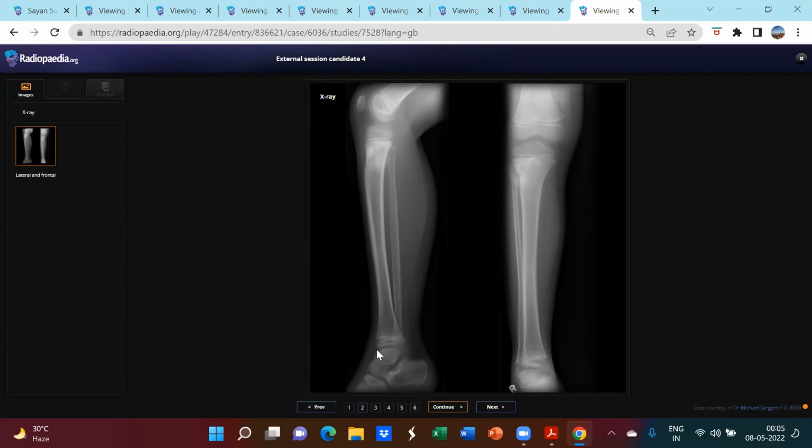An MRI would have helped, I think, but MRI helps in what? MRI helps in the extent of the lesion, as you told, right? The neurovascular bundle, the soft tissue involvement, skip lesions, and METs, right? Yeah. What I'm saying is anything that will help in the primary characterization of this lesion. Well, for that MRI might not be very helpful.